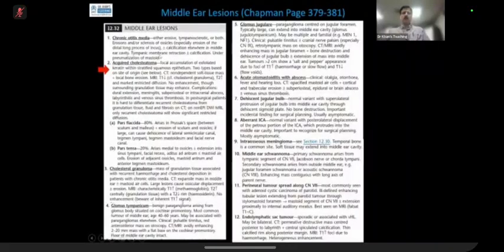So this is from Chapman. Cholesteatomas, of course, can be congenital and they can be acquired. We are talking about acquired cholesteatoma here. The classical location includes pars flaccida, which is 80%, pars tensa is 20%. Candidate 2, you can see my slide, Chapman's slide.